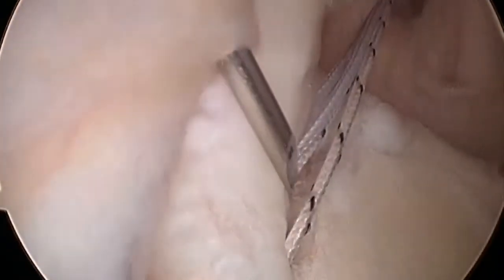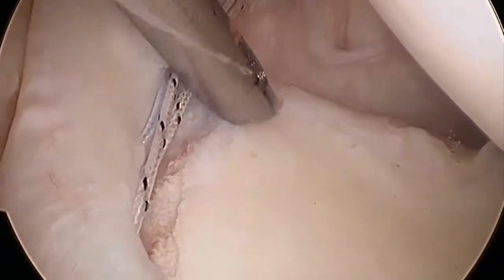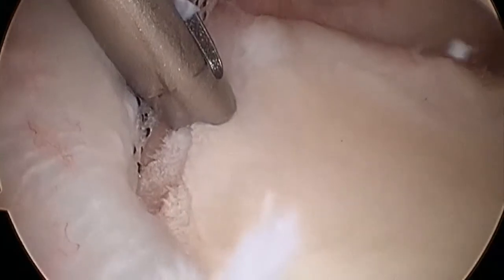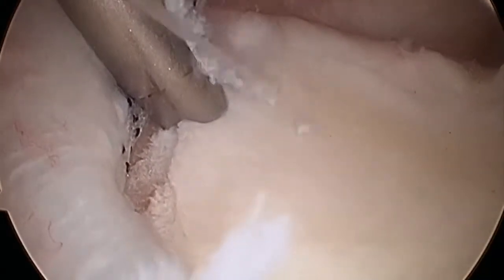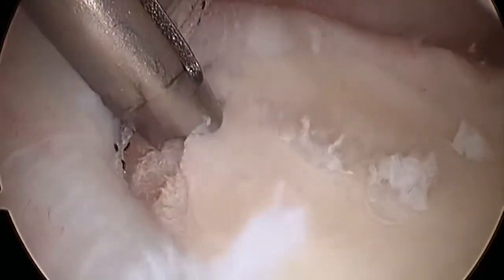An additional portal is made just lateral to the acromion for the insertion of the anchors. A 2.9mm push lock guide is inserted via this portal and both holes drilled.